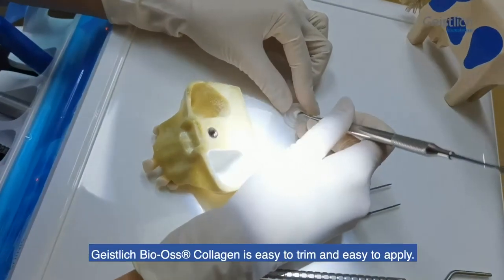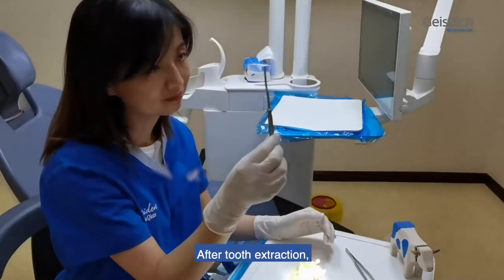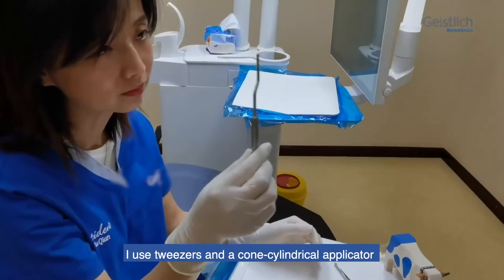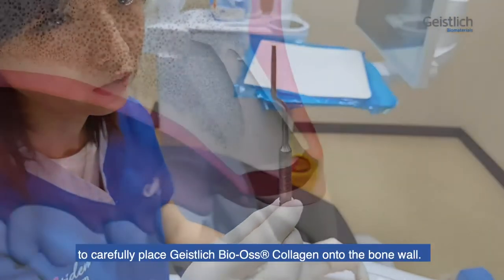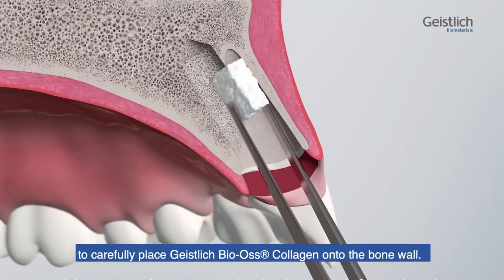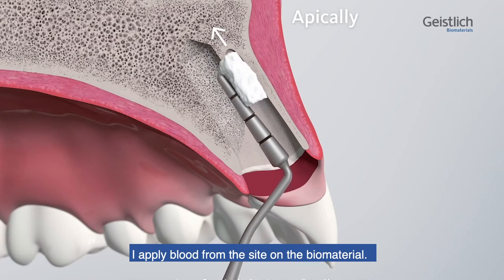Gasterly bioscollagen is easy to trim and easy to apply. After tooth extraction, I use tweezers and a cone cylindrical applicator to carefully place Gasterly bioscollagen onto the bone wall. I apply blood from the side on the biomaterial.